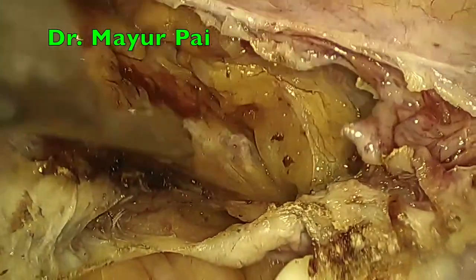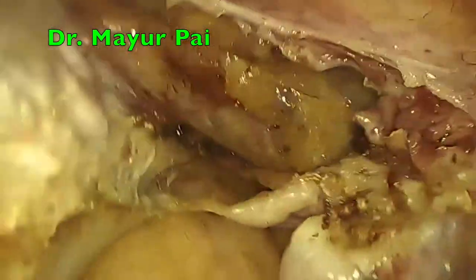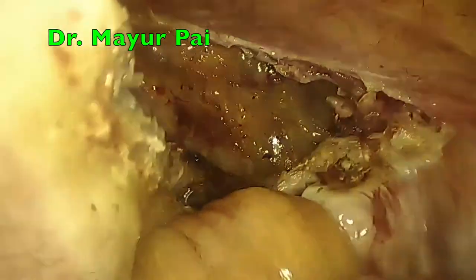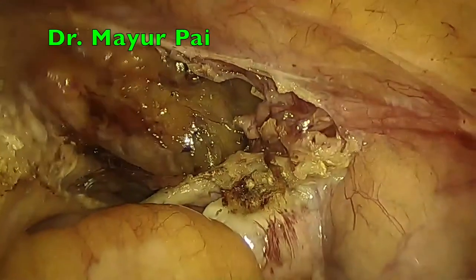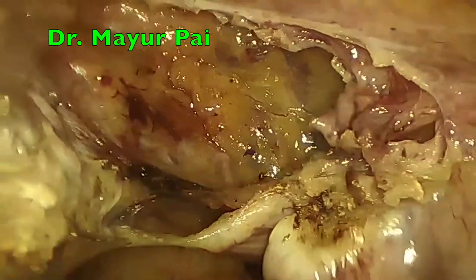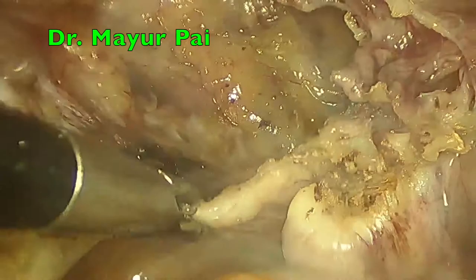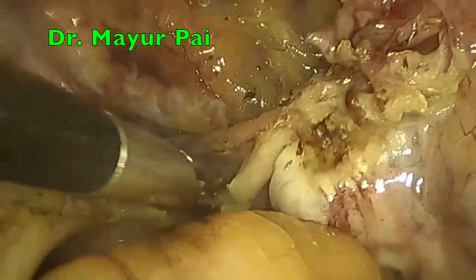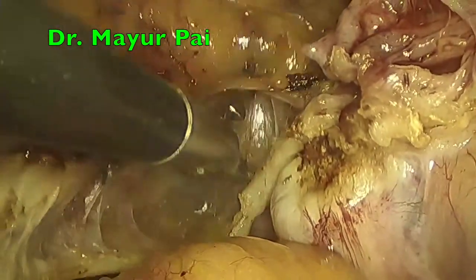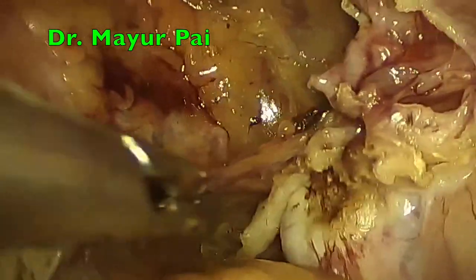This process is called skeletonization of the uterine vessels, where the uterine artery, which is more anterior, and the uterine vein, which is located more posteriorly, are made devoid of any connective tissue in front and at the back. This helps us to get a better grip on the structures and to better coagulate them, and helps also in cutting. Also, in case there is some untoward bleeding or some accident that occurs, then it is way easier to deal with the problems.